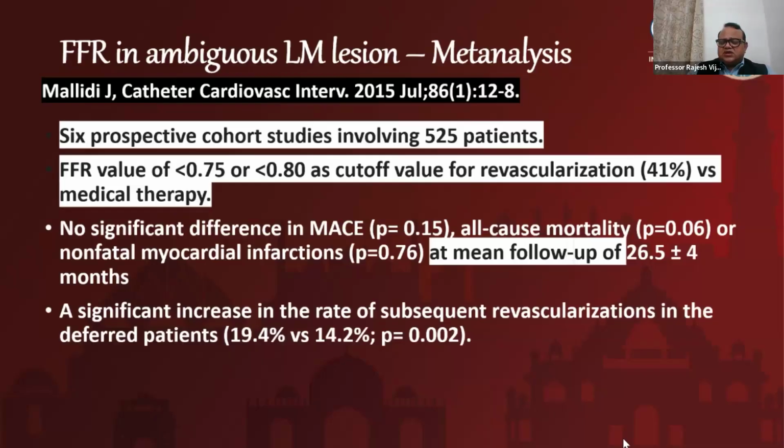However, there is significant subsequent revascularization in deferred patients compared to those who had been revascularized.